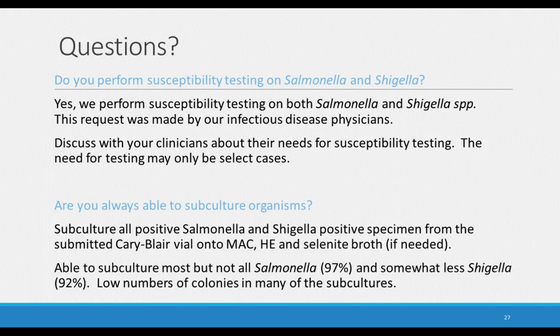Do they need susceptibility testing? They may need both, they may need neither, or perhaps they only want Shigella tested. But this is something that you need to discuss with your own physicians in your own institution.